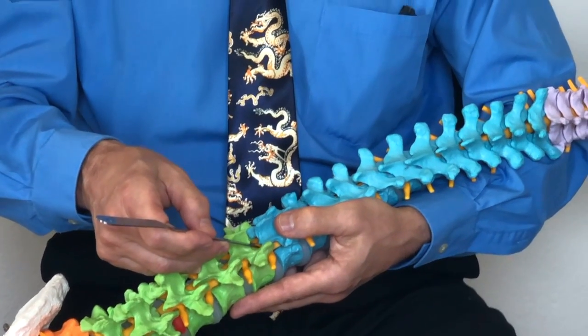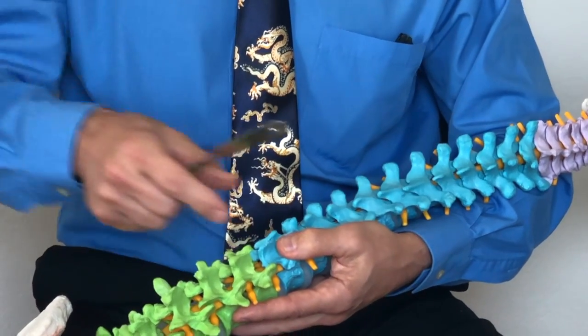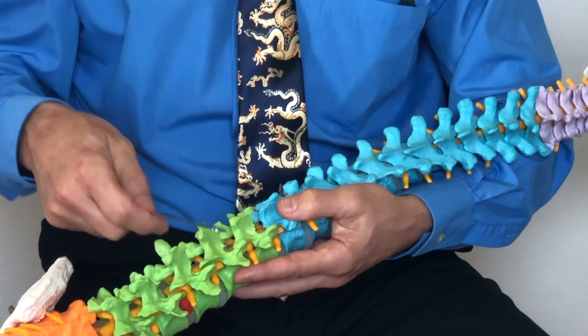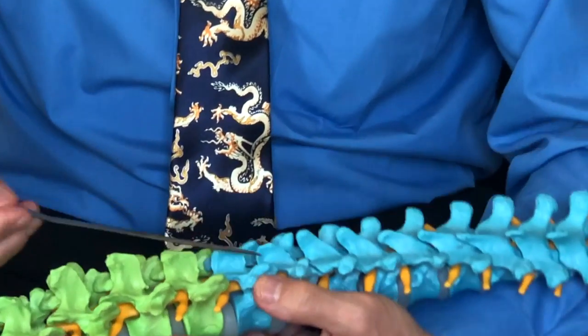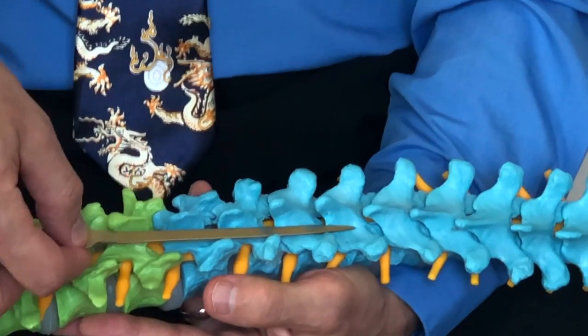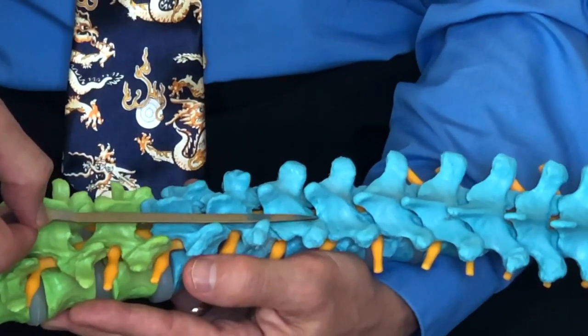Once the needle is placed into the spinal canal, a string of electrodes, which are arranged in single file on something that looks like a wire, is threaded through this needle and then advanced several levels up the spine, approximately like that, except it's inside the spine and you wouldn't be able to see it.